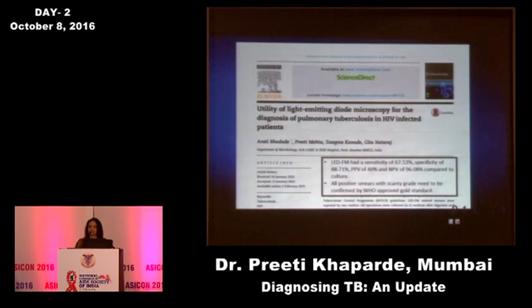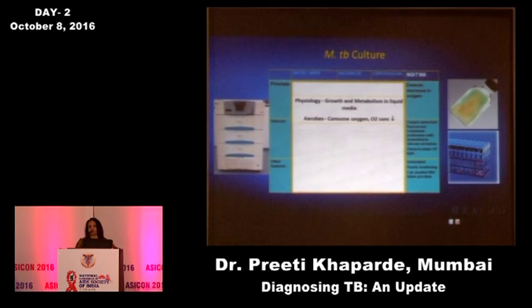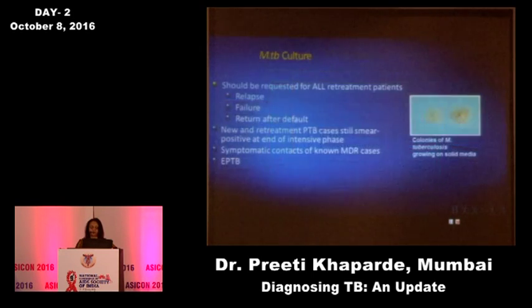Our experience at KEM also showed us that it was very sensitive and specific. Coming to culture, there are various liquid culture methods available, but the only one recommended for drug susceptibility testing by WHO is the MGIT 960.